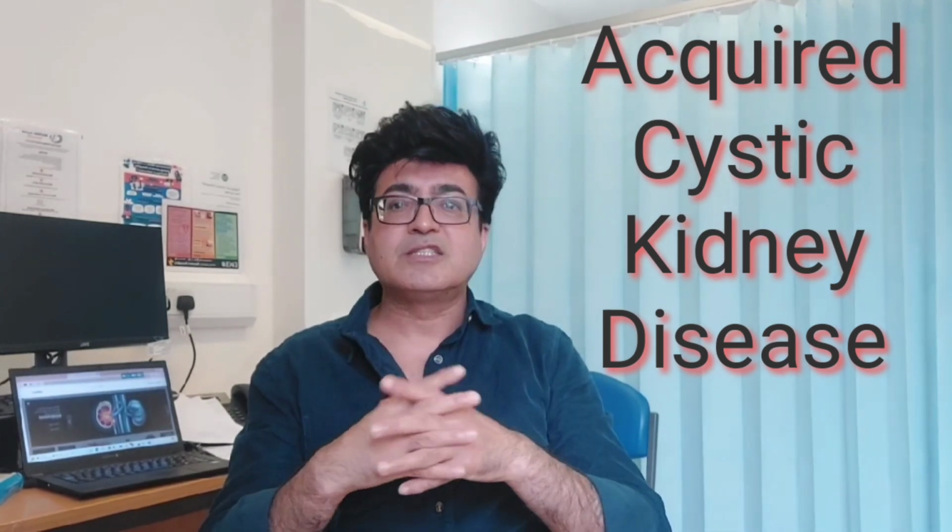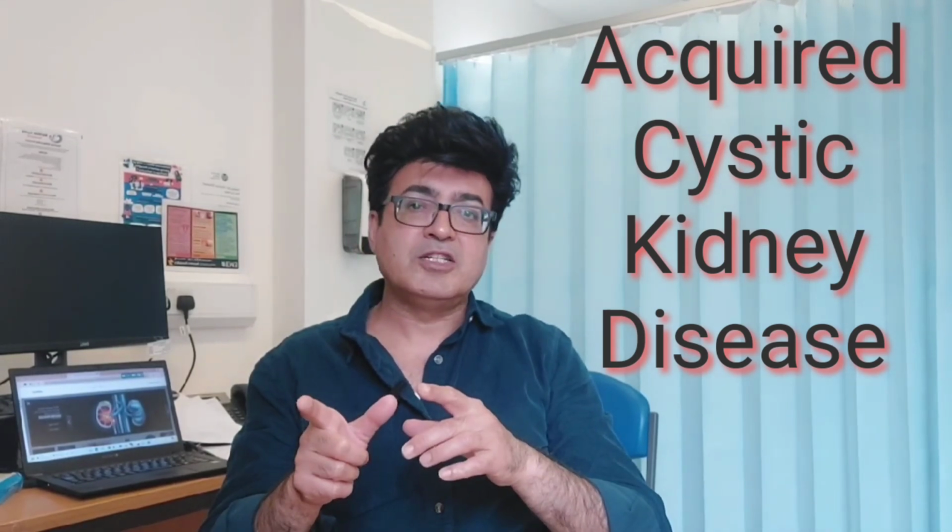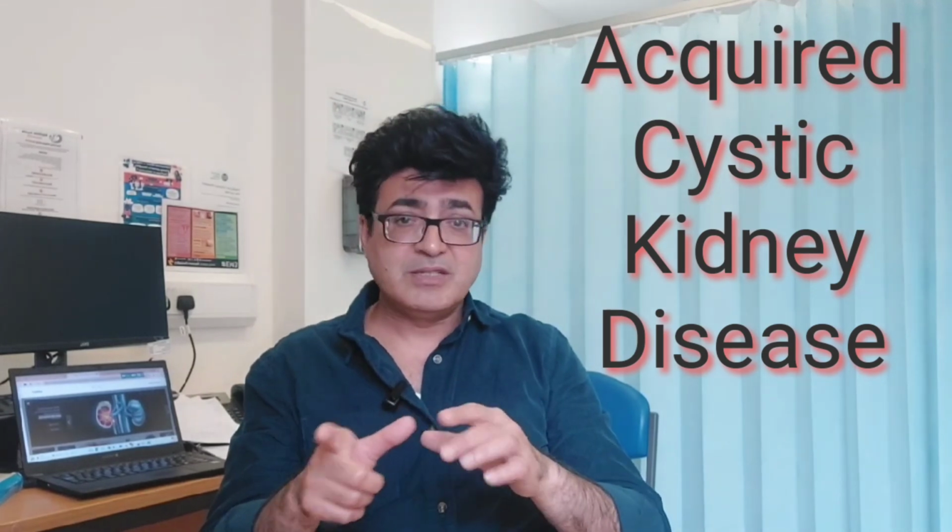So these 2 points are worth noting. And the second thing is that the kidney of the patient would be either small in size or normal in size, as I mentioned earlier, which makes it different from adult polycystic kidney disease.